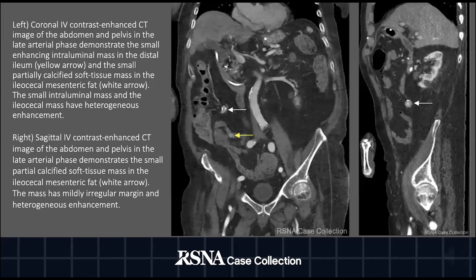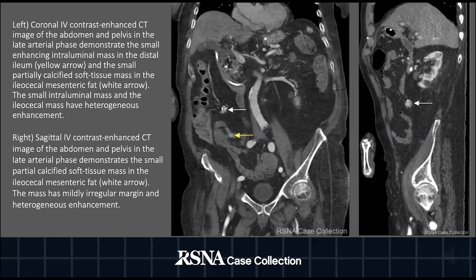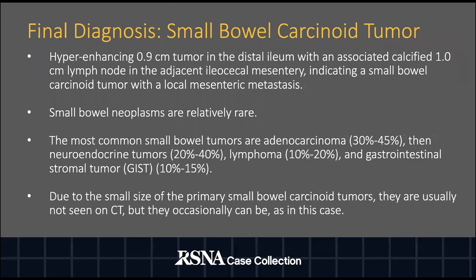On the left, a coronal view of the same CT demonstrates the small enhancing intraluminal mass in the distal ileum labeled by the yellow arrow, and the small partially calcified soft tissue mass in the ileocecal mesenteric fat labeled by the white arrow. On the right, a sagittal view demonstrates the same partially calcified soft tissue mass in the ileocecal mesenteric fat labeled by the white arrow. Imaging findings are consistent with a small bowel carcinoid tumor with local mesenteric metastasis.